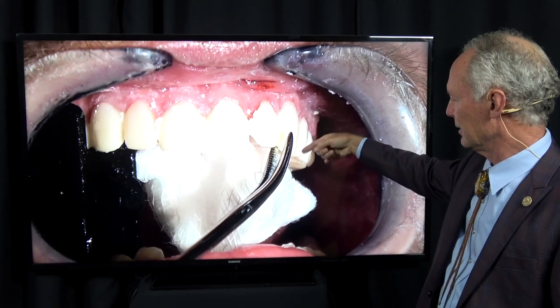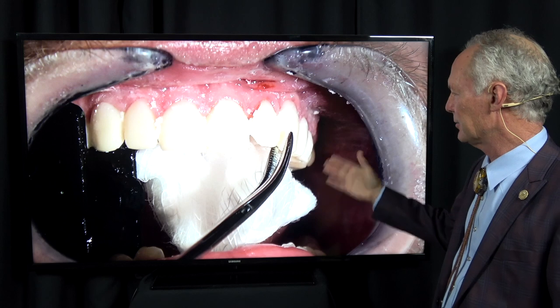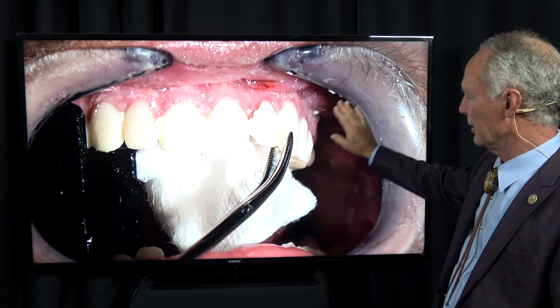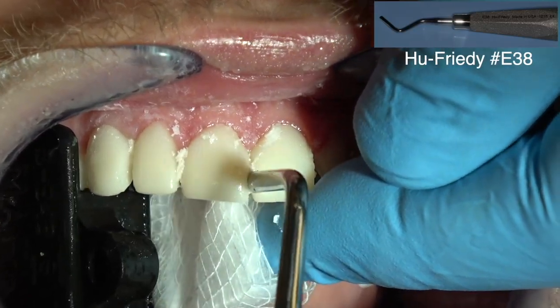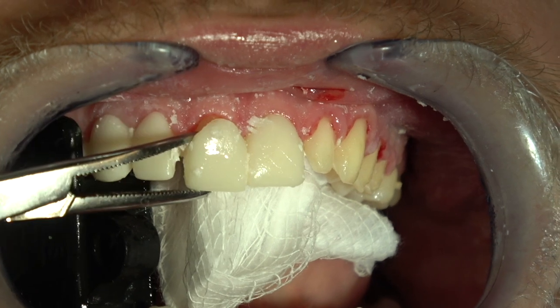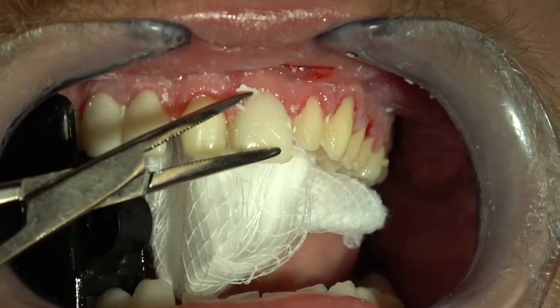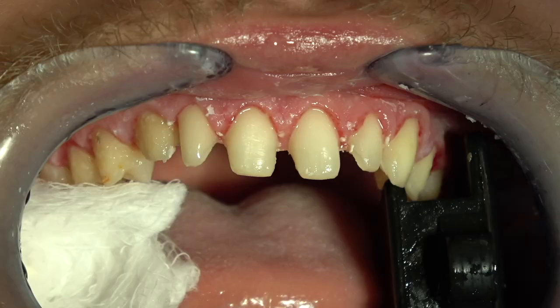I did break the interproximal contact in these cases because they had a diastema, but I didn't break it very much, so I don't want to cut the tooth. So I'm probably going to take those off in one piece. And you just torque it with some type of elevator, and they'll come right off. Put a 2x2 in the mouth so you don't have a patient swallow one or aspirate one.